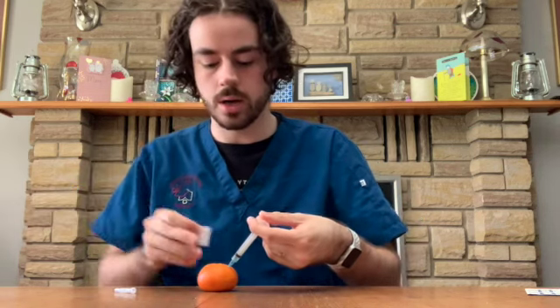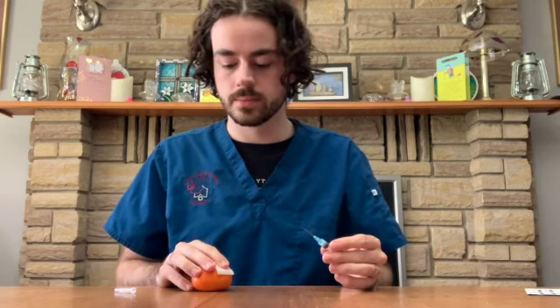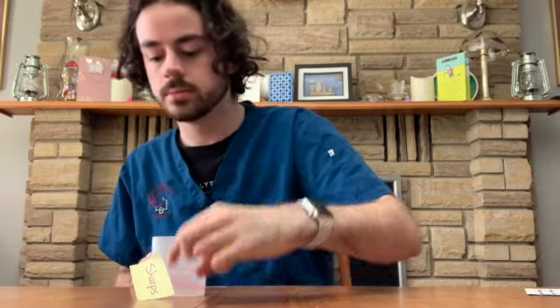And then I'm just going to put a cotton ball on the injection site when I take it out, just in case there's any bleeding. And then I can put a Band-Aid on it. I'll recap my needle, and the whole syringe can go in the sharps container.